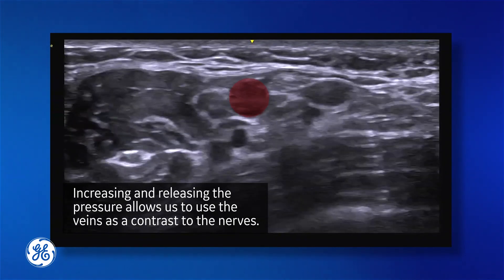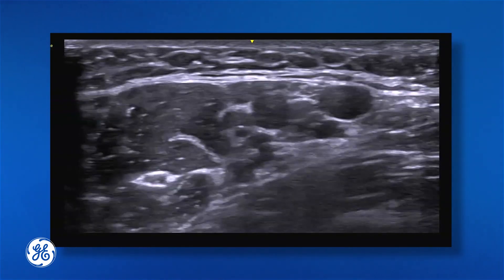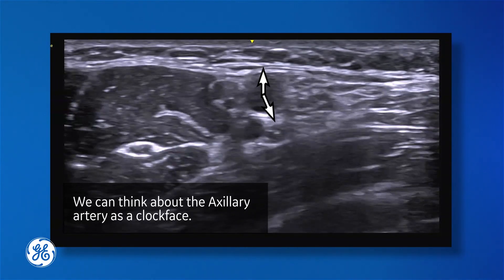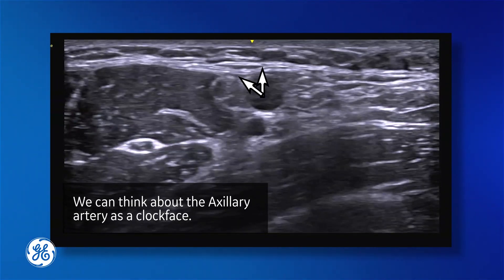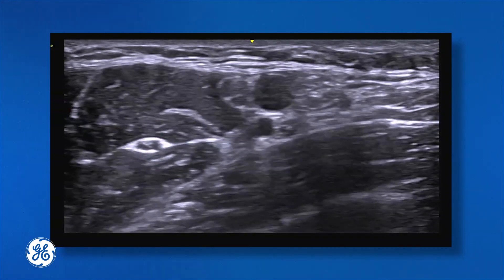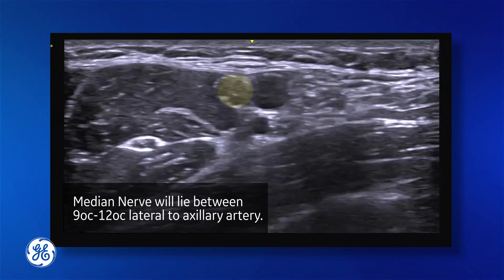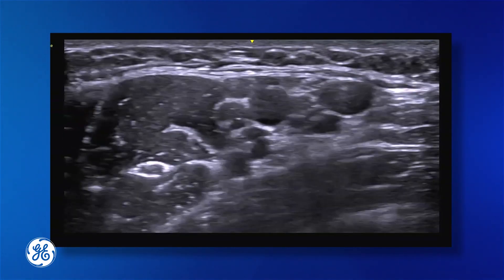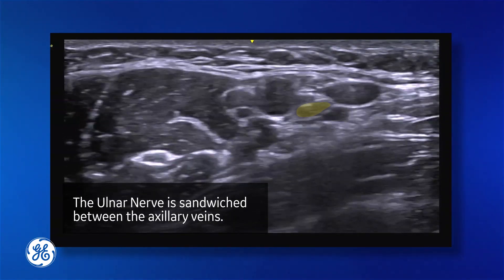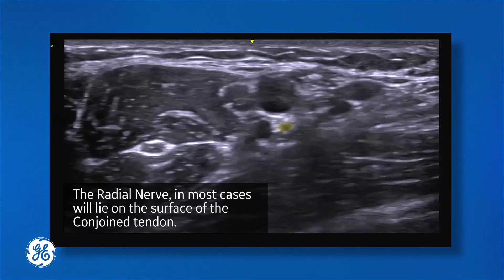We're going to place our artery into the center of the screen. When we take off our pressure and reapply, we're going to use our artery as our landmark. Looking between 9 and 12 o'clock, our median nerve will consistently lie on the lateral side of the artery. Between 12 and 4 o'clock we will find our ulnar nerve. And between 4 o'clock and 7 o'clock we will find our radial nerve, which sits right on top.